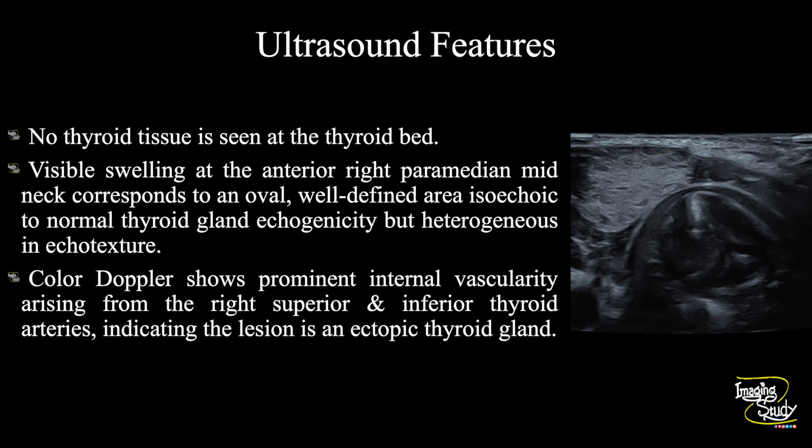In summary, there is no thyroid tissue within the thyroid bed. The visible swelling at the anterior right paramedian mid-neck corresponds to an oval, well-defined, capsulated area that is isoechoic to normal thyroid echogenicity but heterogeneous in echotexture. Color Doppler shows prominent internal vascularity arising from the right superior and inferior thyroid arteries, indicating an ectopic thyroid gland. The vascular flow features also represent thyroiditis in the background.